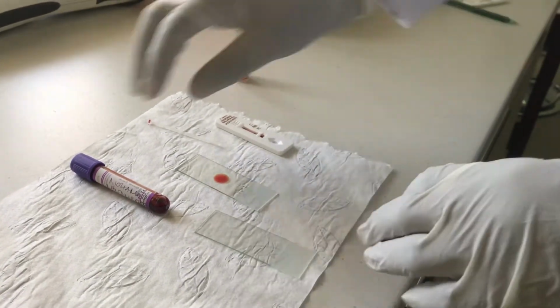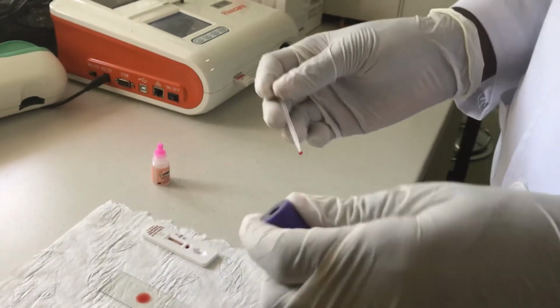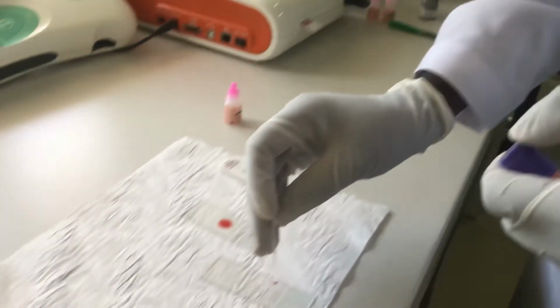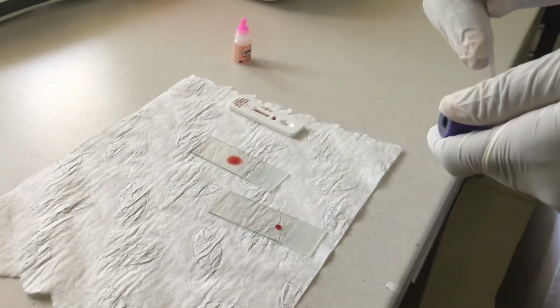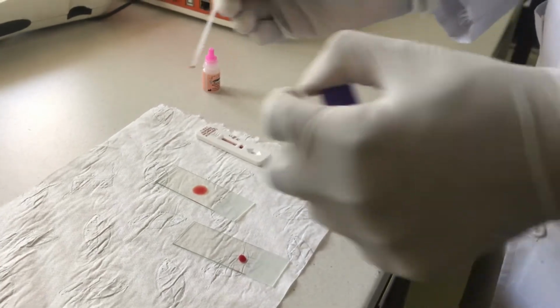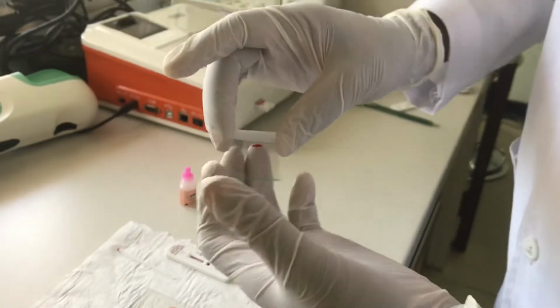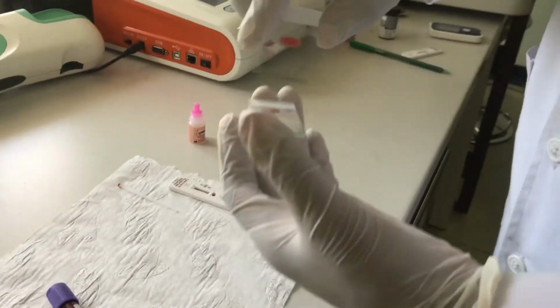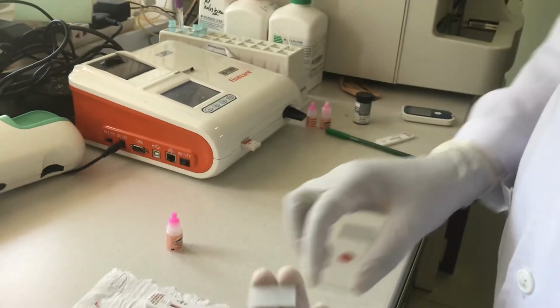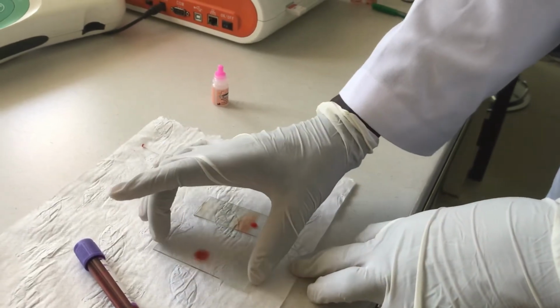If you need a thin smear, because if the test comes out positive, you might have to do quantification and also identifying the species, then you also need to use a thin smear. Just like last time I showed in the previous video, you need a thin smear for quantification. So you can use the same glass slide or a cover slip, and you spread your smear. Okay? So you have your thin smear and the thick smear.